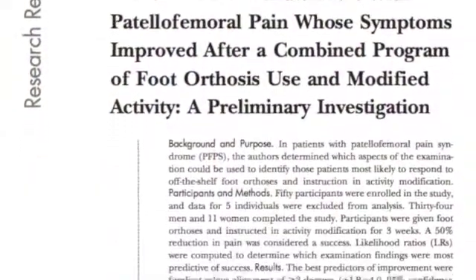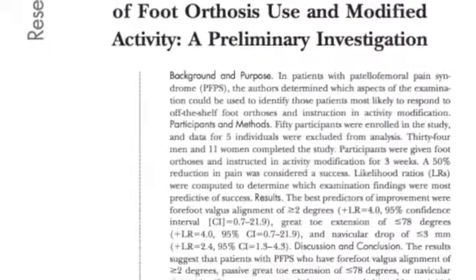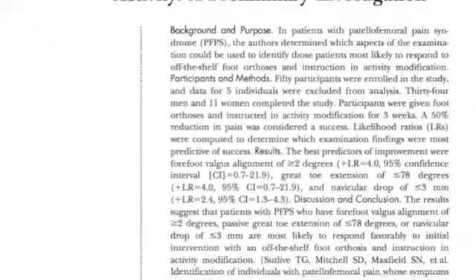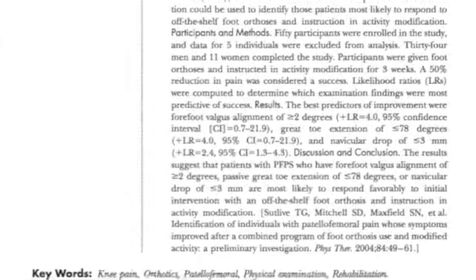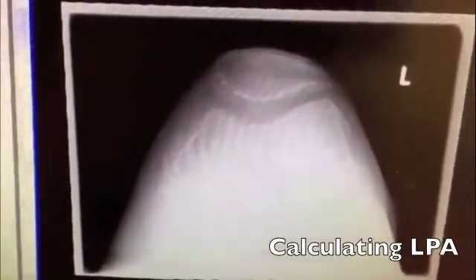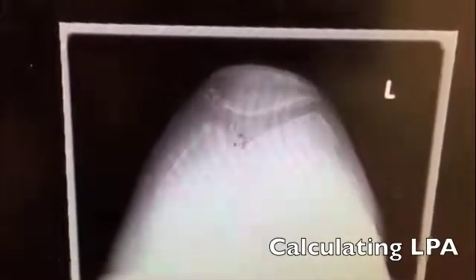to give a quantifiable measure of predicting orthosis success within individuals with patellofemoral pain. It was by drawing a line between the anterior points of the medial and lateral condyles of the femur, and so we're going to draw that on just there.